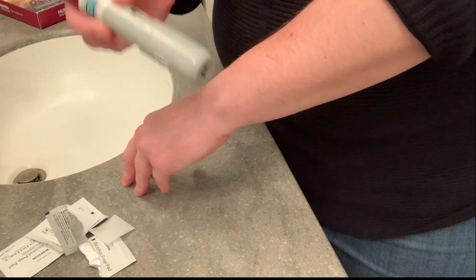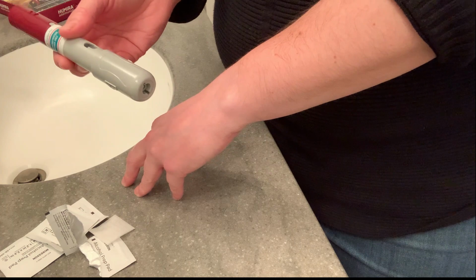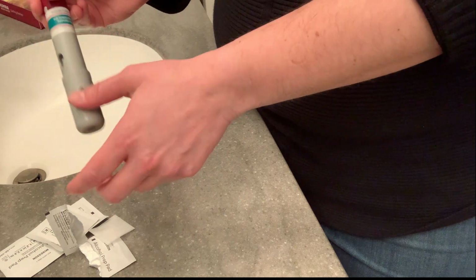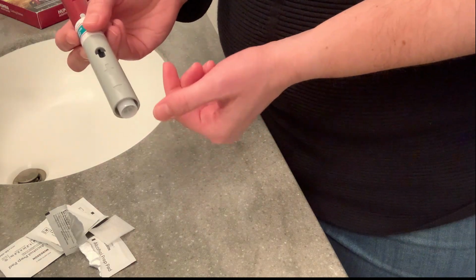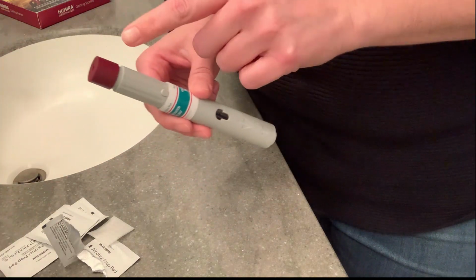The pen you want to leave at room temperature for about a half hour to an hour before you actually inject. All right, so AbbVie makes it easy. So you have one, take the first button off. This is where the injection is, so this is where the needle is. And then number two is the trigger.